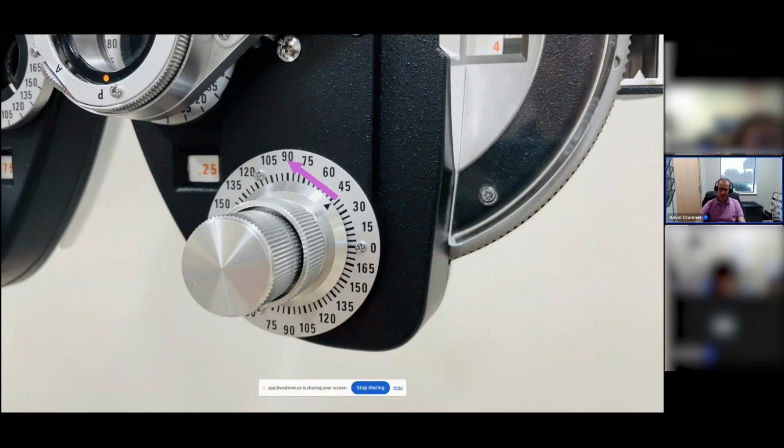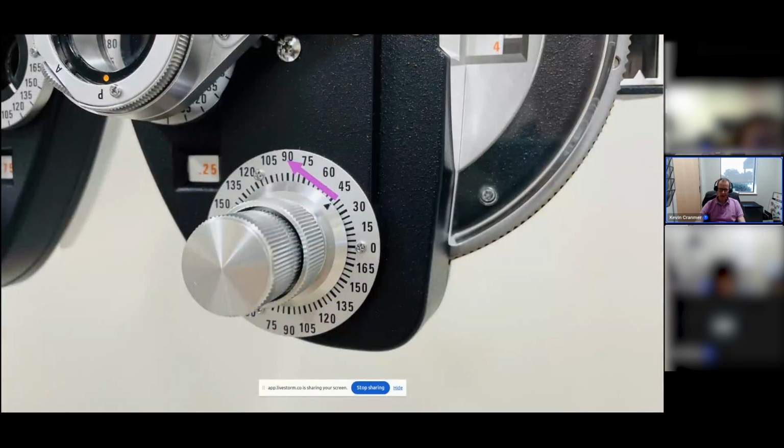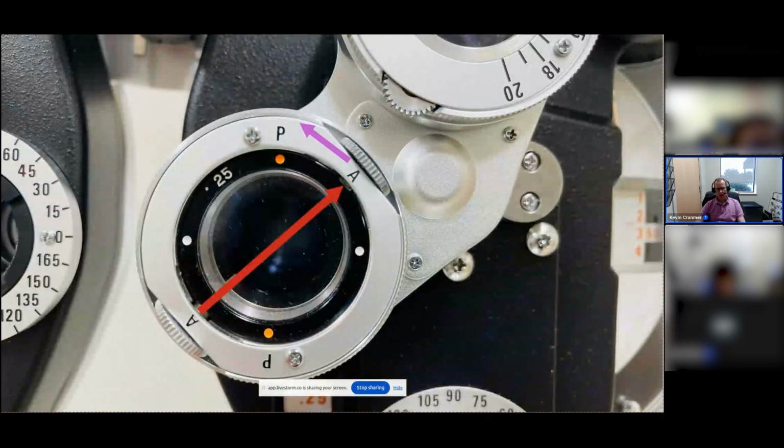But basically, the patient has said, this is the better lens. We know we have to rotate counterclockwise, and then we rotate counterclockwise. We flip it again, and the patient at some point might say, okay, now the other position's better. And so you might go 20 degrees counterclockwise, 10 degrees clockwise, and then the patient says, oh, they're both the same. And then you found the axis of the astigmatism.